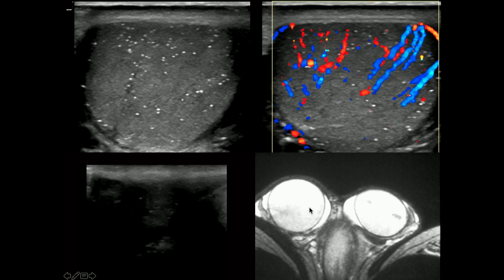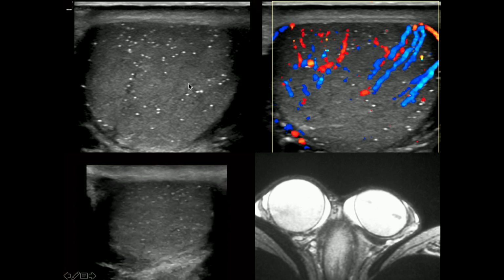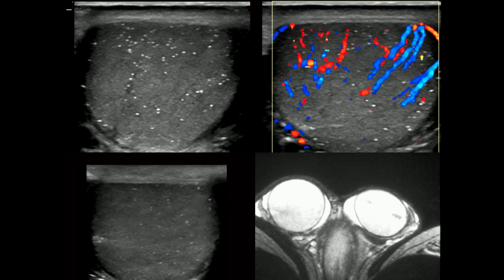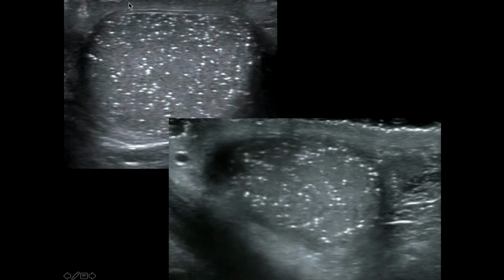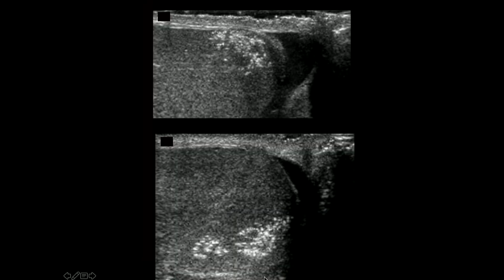And I just wanted to show, remember, high-frequency ultrasound is much better resolution than MR for picking up tiny little calcifications like that. Another classic case. Still 5 or more on one image, you're going to call it. In our paper, we rarely found focal lesions. Most of the time, they're kind of diffuse.